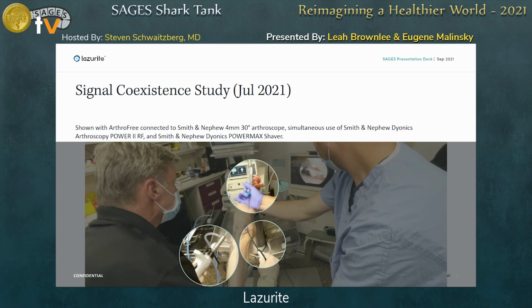And your source is compatible with all the scopes, both flexible, rigid, and 5 and 10 or 3 millimeter scopes?